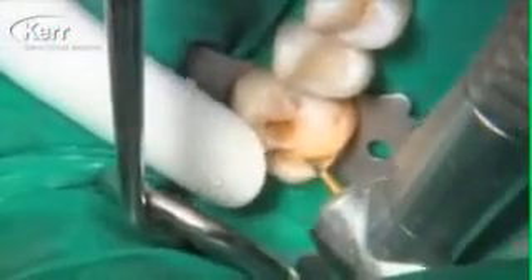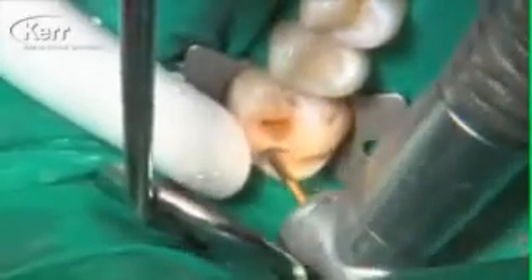The composite is finished and we're moving to the tooth behind it. We've got a small Class 1 occlusal restoration and a two-surface OL restoration behind that.